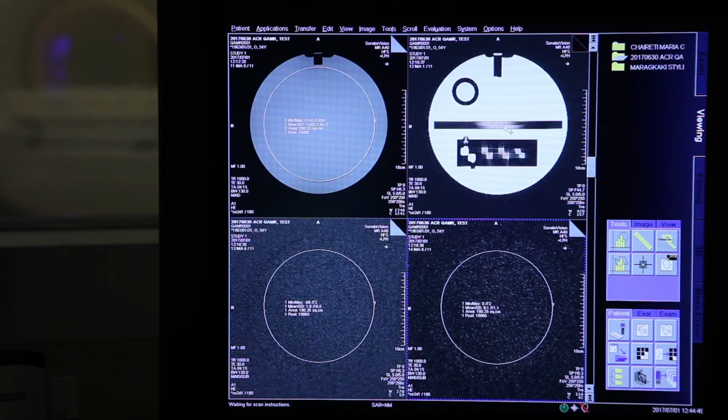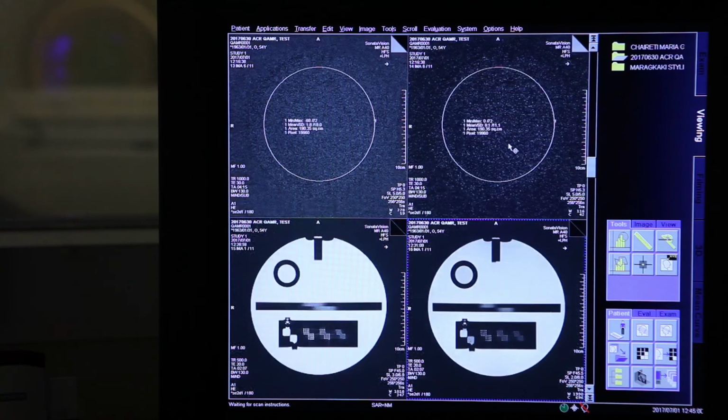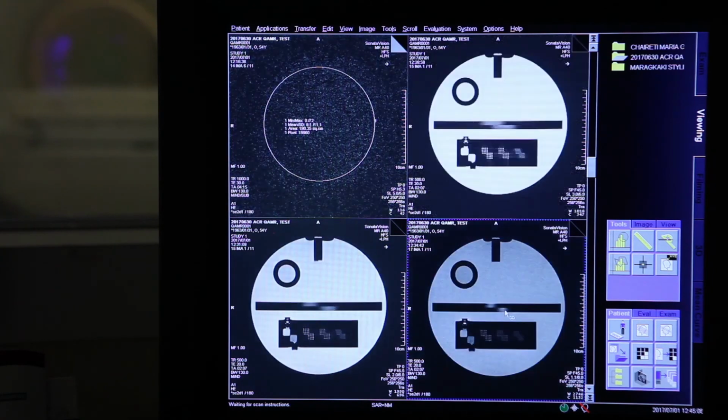But you can imagine now, if there is a small shift or a small tilt in the Y or the Z, they actually change it. You don't mind if these are shifted apart. They don't maintain the center. The only thing you mind is to measure this profile, this size. And this is the 2mm slice. We're going to go with the 1.1mm slice. And they change it.